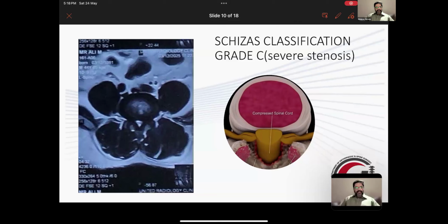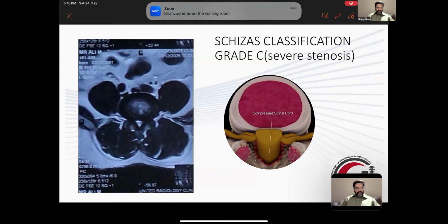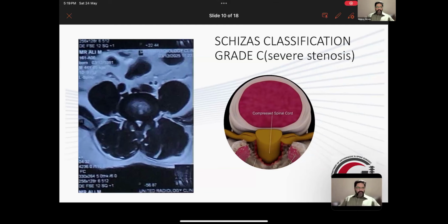We rely first of all on the clinical examination. This is the most important thing, and then you relate your examination with the images. You have standing x-rays or a flexion extension view. And if we are very much confused between any two levels, or we are deciding, you can go for nerve conduction, but usually it's not necessary. If you examine the patient clinically, you decide, and your findings are very much matching with the images. So this is what I do.